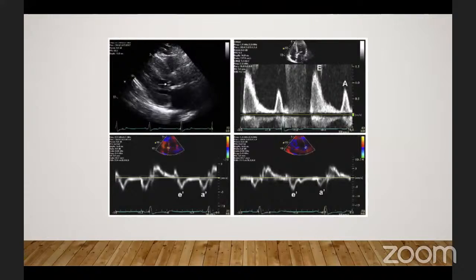Because sometimes the mitral inflow will be variable depending on different parameters. If the patient is having an aortic regurgitation, this will change the preload and affect the value of the mitral inflow pulse result. So the tissue Doppler will give you a much more sensitive measure than the mitral inflow.